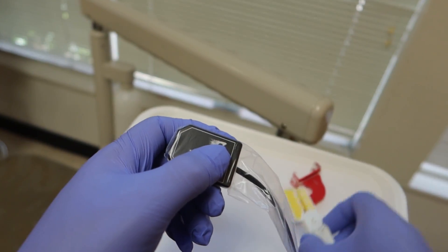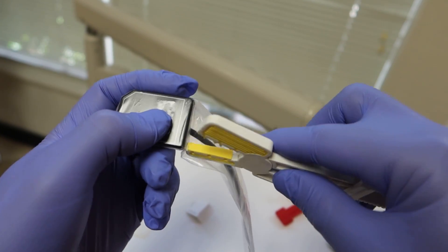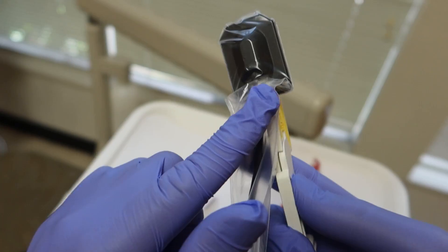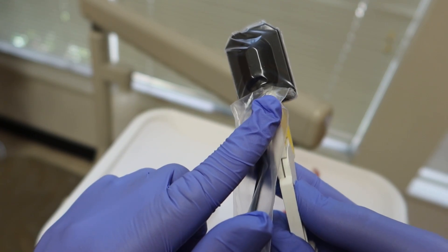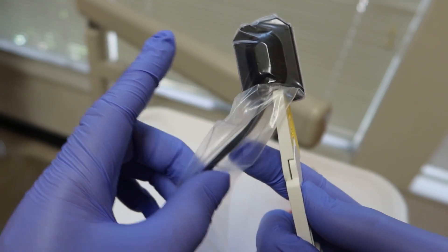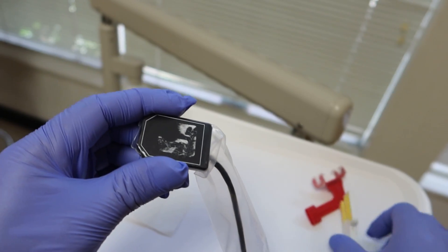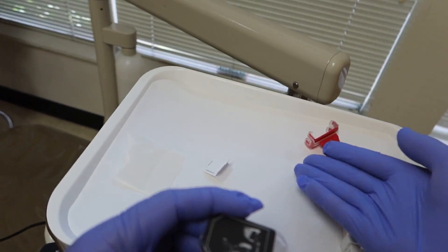Other option that we have here also is using a snap array device, which I can go and take this and have it bite down right in the middle. Just be careful where the wire is, because you might end up banging up the wire and making not a happy dentist when they come back to their equipment. So it's nice to stick to either your tabs or your claw doodads.